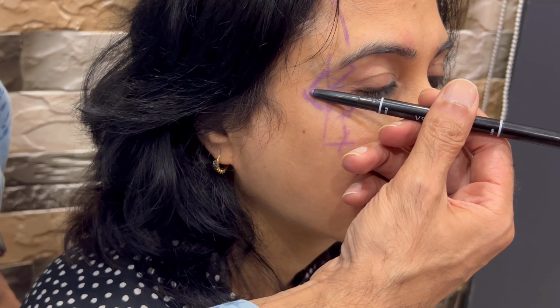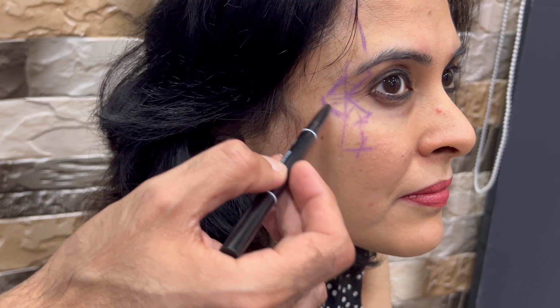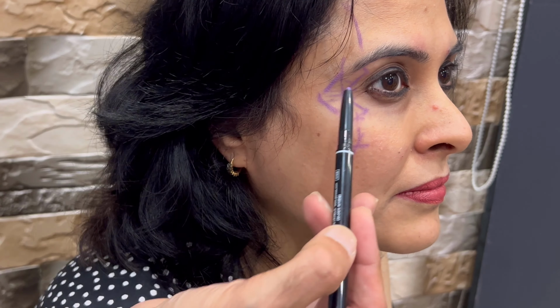Okay, so at the injection point the bevel is always parallel to the skin and you're raising a bleb, because the muscle is subdermal and you don't want to inject deep. Okay, so I did 4, 4, 4 and 4, 4, 4, and this is about 1 to 1.5 centimeter away from the lateral canthus. So I did 12 units on this side, 12 units on the opposite side, and 20 before. So 24 plus 20, that's 40, and 12 and 12, that's 64. The standard technique.